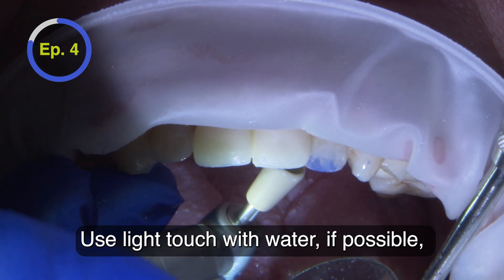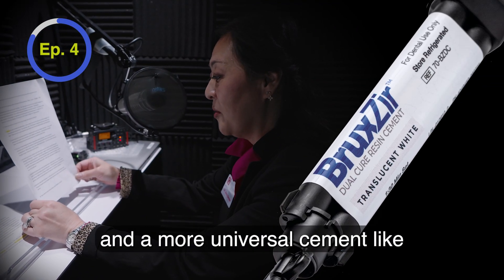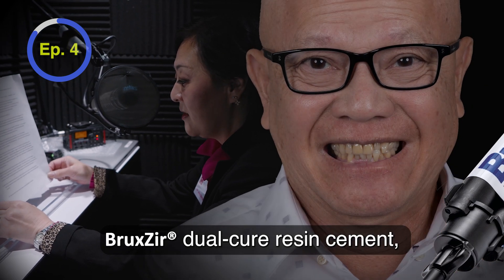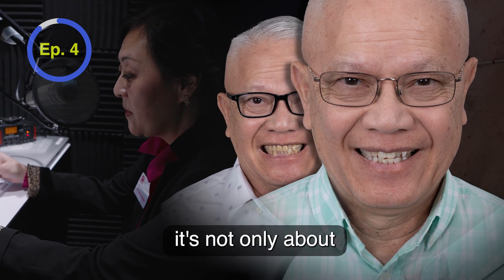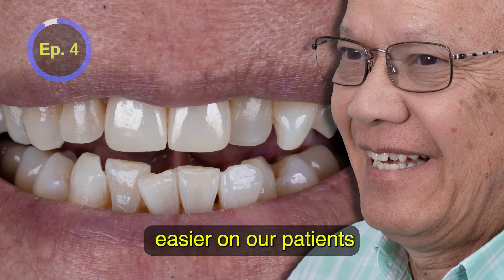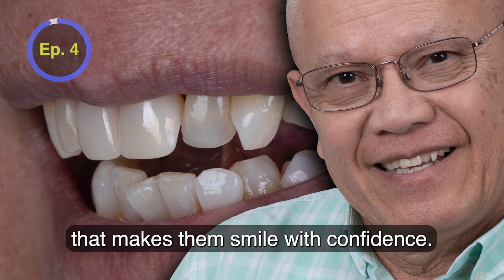Use a light touch with water if possible at a maximum of 20,000 RPM. With a simplified protocol and a more universal cement like BruxZir Dual-Cure Resin Cement, zirconia cementation has never been easier. At the end of the day, it's not only about making it easier on us — it's also about making it easier on our patients and giving them a same-day, beautiful zirconia restoration that makes them smile with confidence.